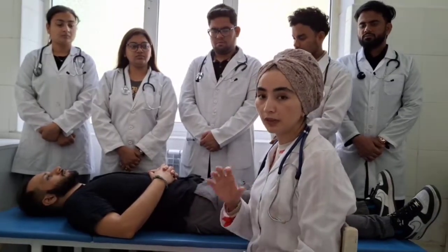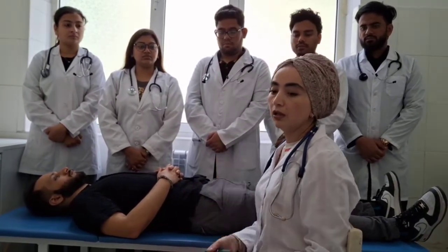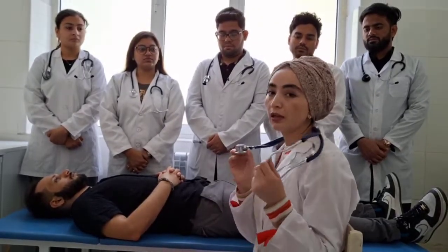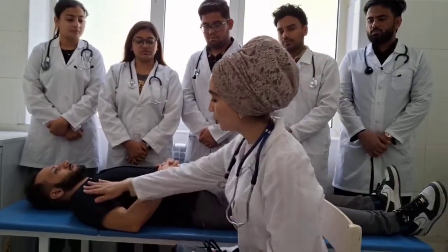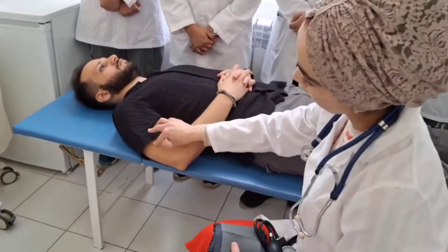Urination should be done beforehand, because a full bladder also increases blood pressure. Nowadays we use the Korotkoff method of checking blood pressure — Korotkoff introduced checking using a stethoscope. The shoulder should be exposed.